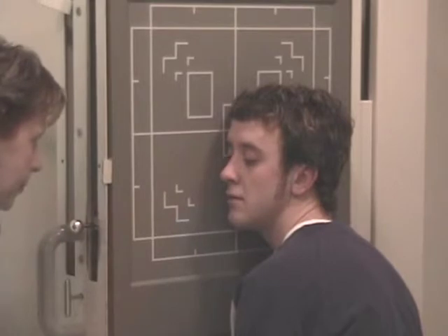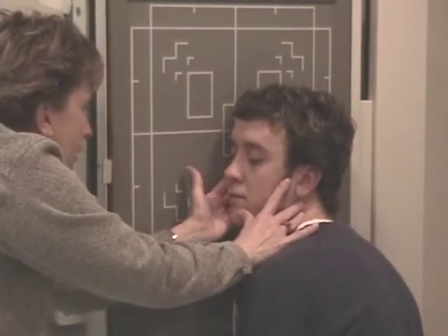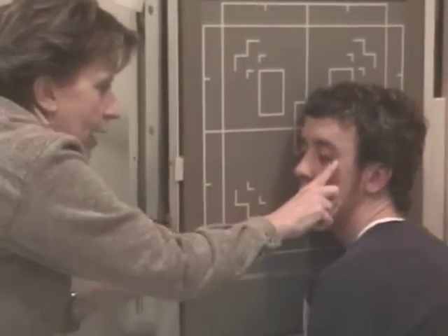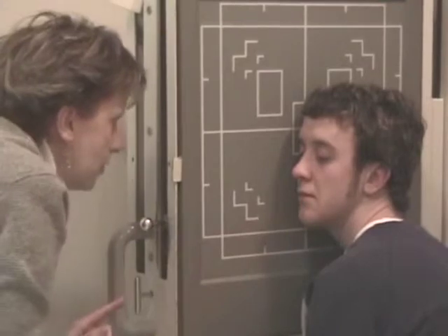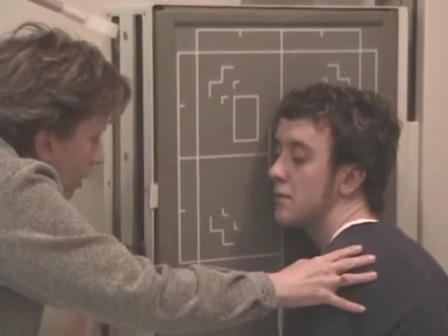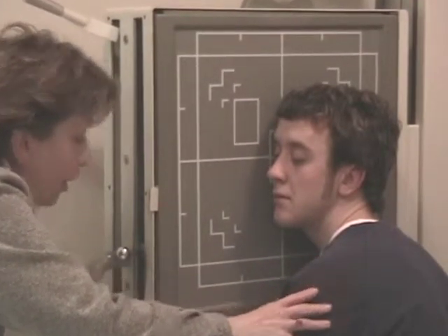Interpupillary line perpendicular, and the MSP is parallel. I'm looking at the outer canthus, lateral border of the skull, making sure that's equal distance. So I'm going to lower the board a little bit. That's good. And you're going to be centered at the level of the outer canthus of the eye.